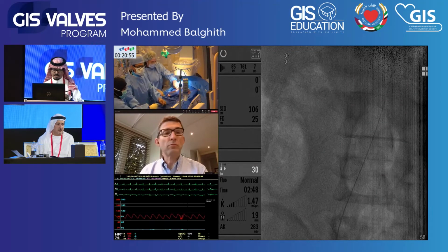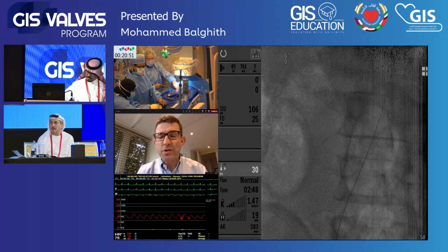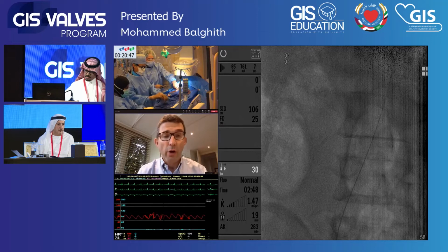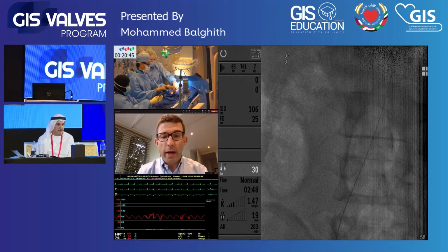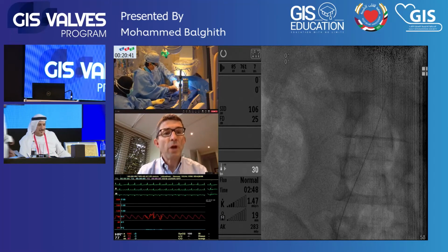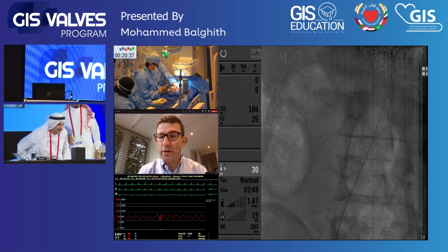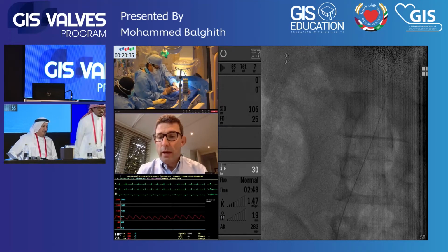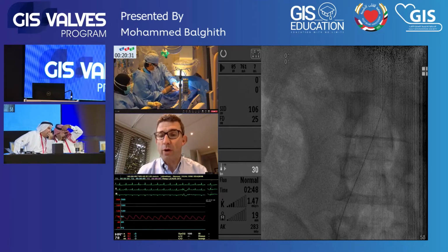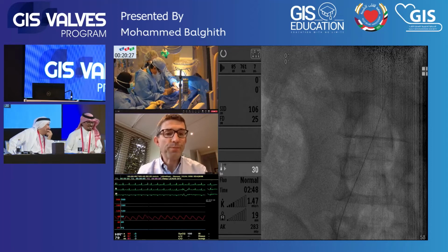Do you do two ProGlide or one? Yeah, good question. Still currently 2 ProGlides, but increasingly we are going to 1 ProGlide and an Angioseal after. Preferably 2, maybe. I still prefer the first ProGlide to take well. That takes well, I feel happy. So we tend to reserve the Angioseals for when the ProGlide doesn't take as you would wish it to.